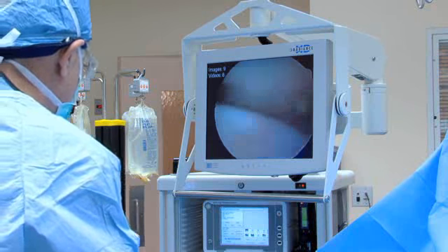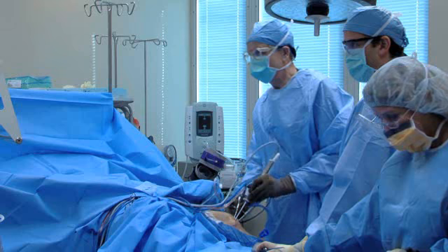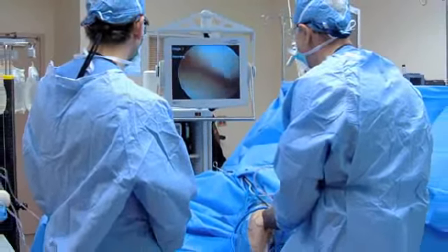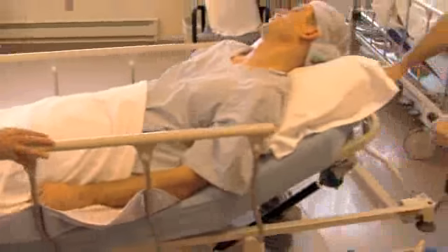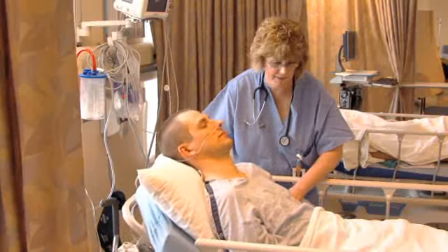If the problem can be corrected, the doctor will make another small incision and introduce operating instruments into the joint. Sometimes several openings are needed. The doctor watches the television screen so he can see what he is doing inside the joint. When you wake up in the recovery room, you'll be drowsy and should not have much pain. However, the Novocaine will wear off several hours later and the knee will be painful.